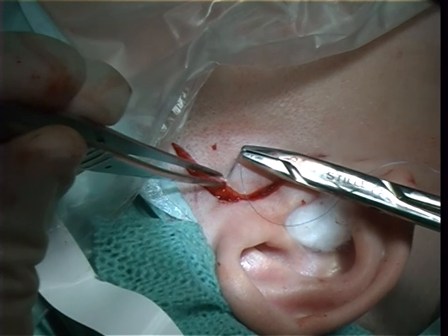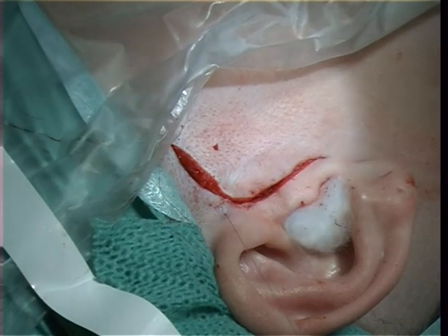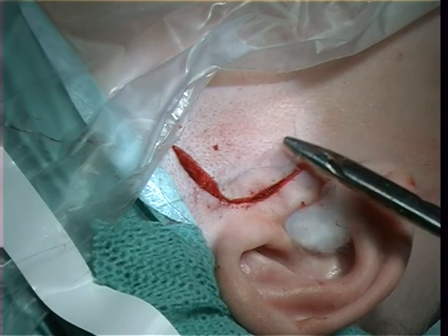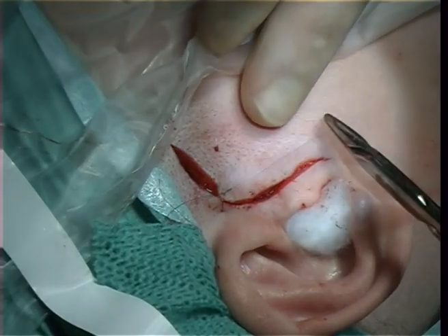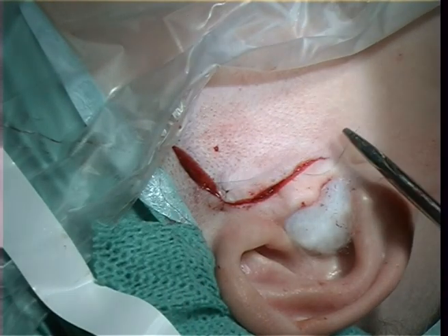Then we go for a nylon thread which is 5-0. We put in separate sutures to hold the skin in place. The patient will have them for about one week when we take them out.